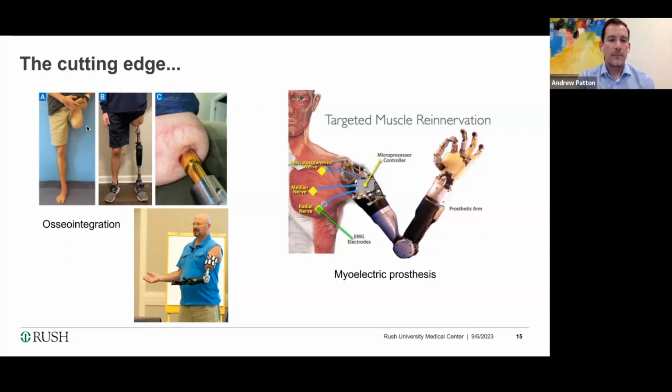But they actually, so this gentleman had an above knee amputation, and what they've done is taken a pylon here and they've actually fused it with his femur. So there's a component of it that's intramedullary. If you were to look into that femur right now, you'll have the cortical bone, and then you'll have that medulla area in the middle where a medullary rod would go if they had a fracture, where there's a component that's going into there up through that hole all the way up as far as it'll go, and then it interfaces right at the bottom of that distal part of the femur, and then goes through the skin, and the skin heals around it like that.